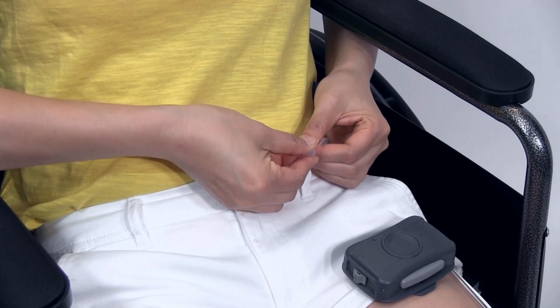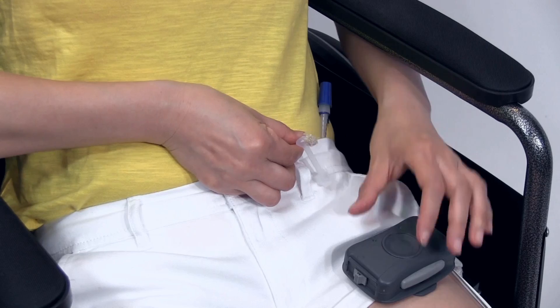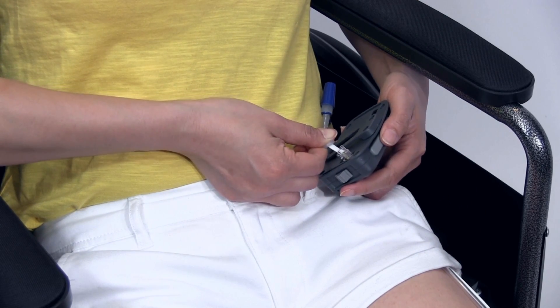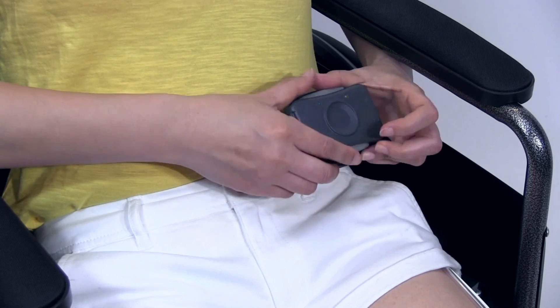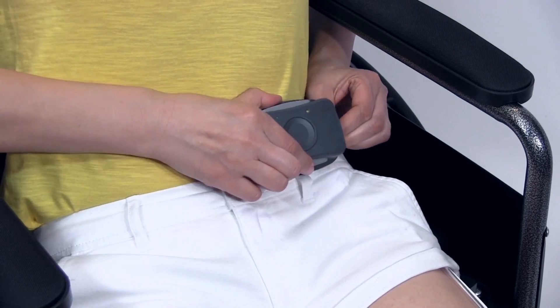Uncap the controller cable connector. Insert the power cable into the back of the controller until it clicks in place. Slide the clip on the back of the controller over your waistband and or belt.